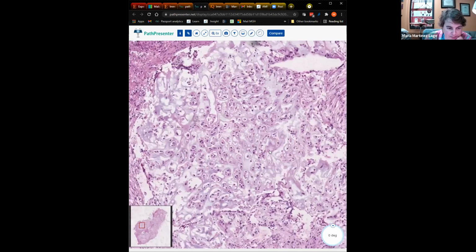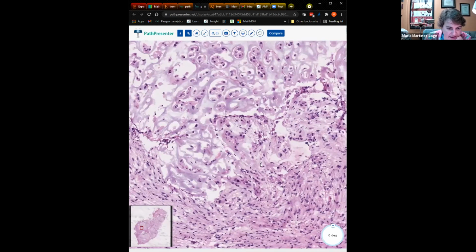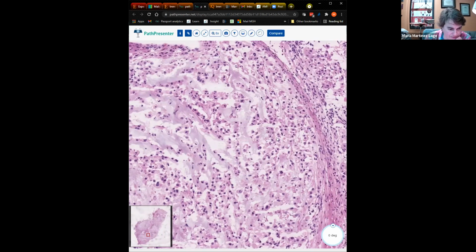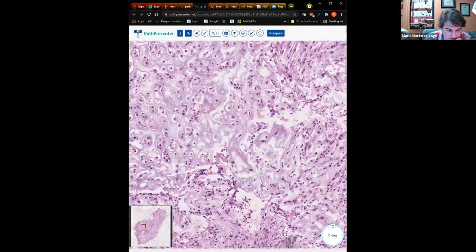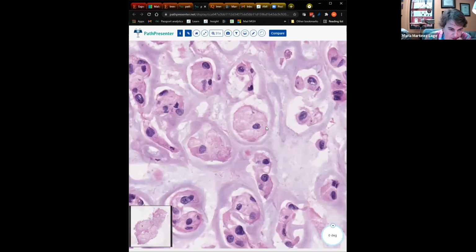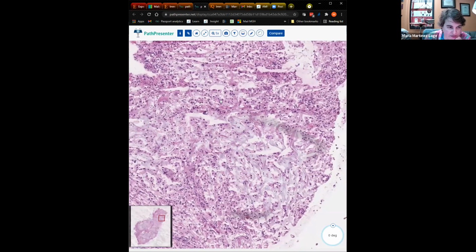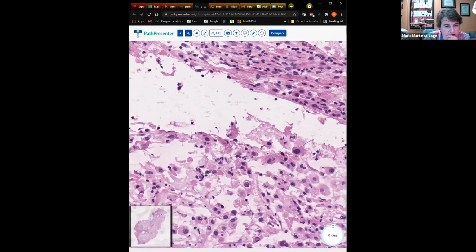Okay, here we go. They're characterized by this myxoid background that tends to be light blue, like any other myxoid material, and they're admixed with cords of epithelioid cells that are usually eosinophilic, and with larger cells that are vacuolated, called physaliferous cells. So I think there were a couple here that were good for a physaliferous cell. That could be one example. There are lots of cytoplasm, ideally more vacuolated than that, and an eccentrically placed nucleus, again in a background of myxoid material with many eosinophilic epithelioid cells.